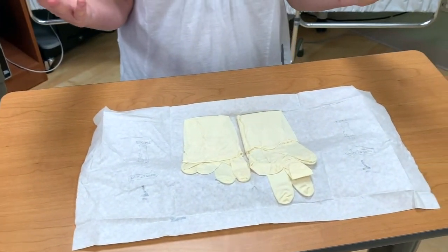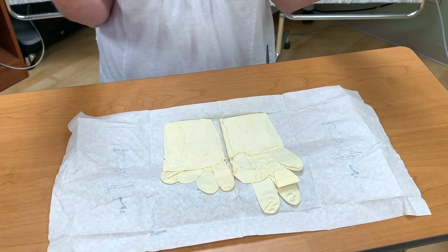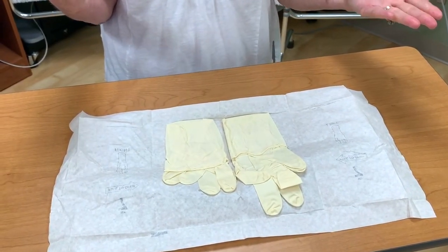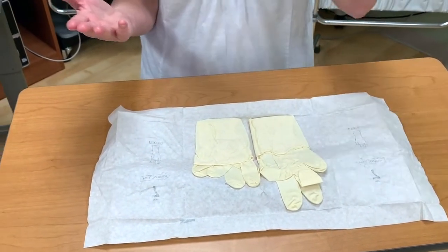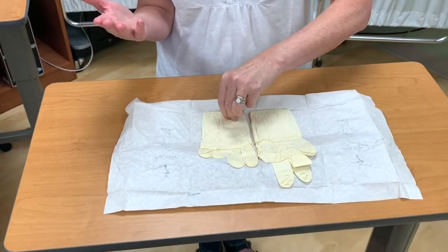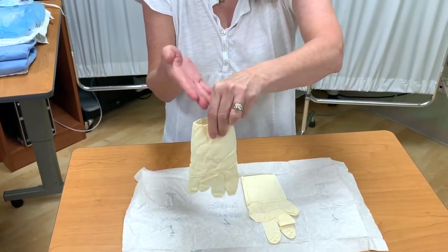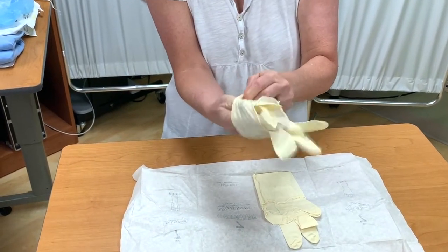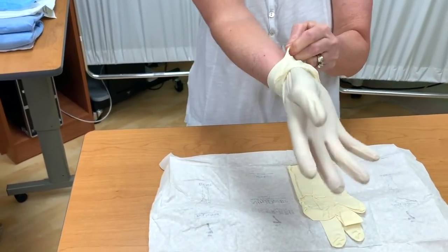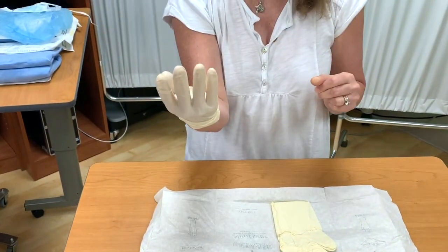Depending on which source you go to, some sources say glove your dominant hand first, some sources say glove your non-dominant hand first. I learned to glove my dominant hand first, and so that's what I'm going to do. This is not sterile. The inside of the glove is not sterile. I'm going to pick it up, slide my hand in. The hand that's being gloved is pushing this way. The hand that is holding the glove is pulling this way.